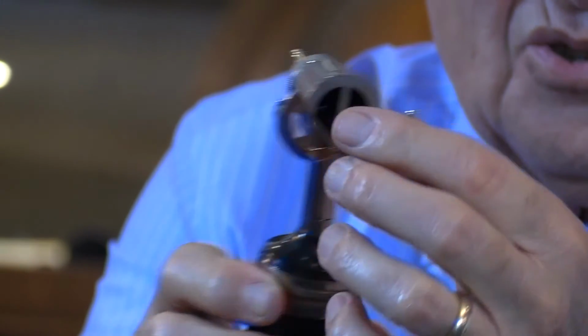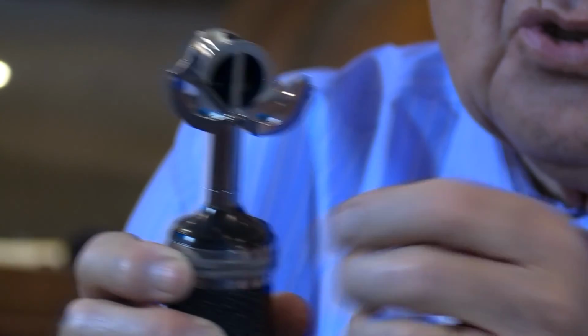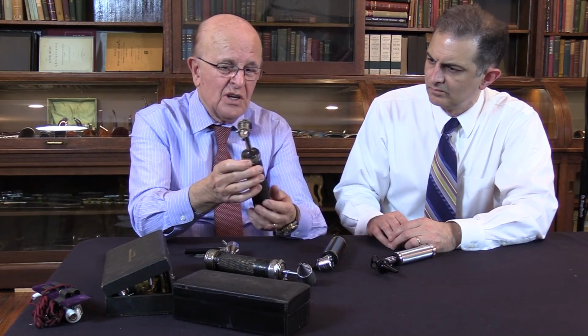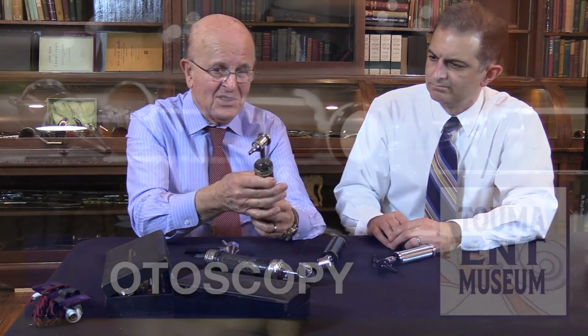You can open them, and each lens has a different power, so it serves several purposes. You can use different power magnification, and also you can introduce an instrument, or you can close it completely and use it for pneumatic otoscopy. This is extremely rare. I haven't seen other than this sample in my collecting years.